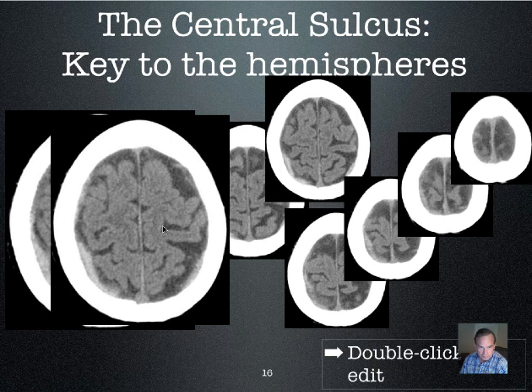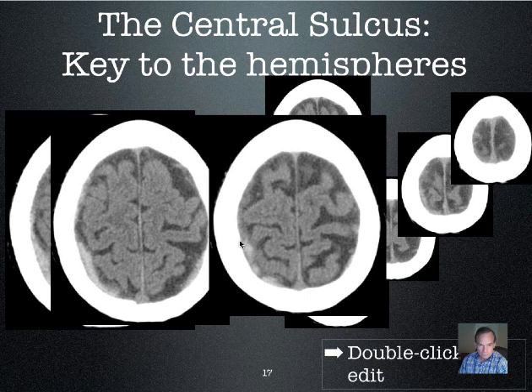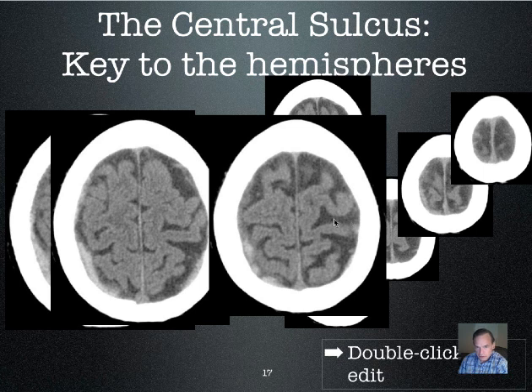At another level, the same technique applies: cingulate sulcus, forward and to the side — central sulcus. Once you see the central sulcus, you know the motor cortex of the frontal lobe is in front and the sensory cortex of the parietal lobe is behind. Going up higher, there's really nothing else quite like this little mustache structure, so it remains identifiable at multiple levels of the brain.